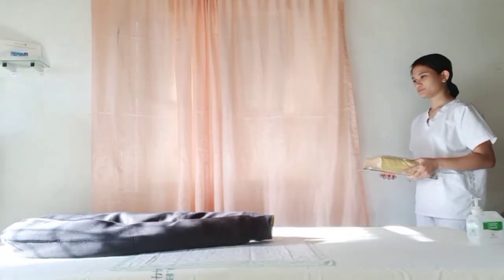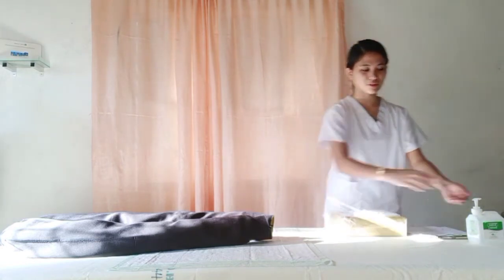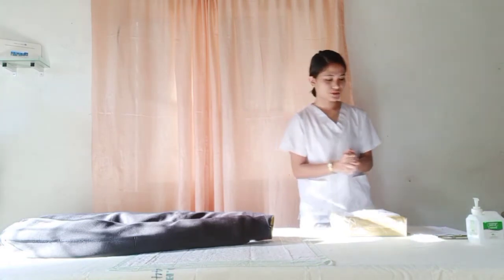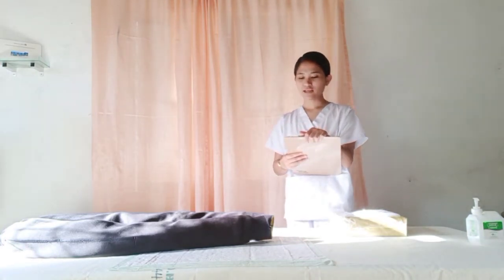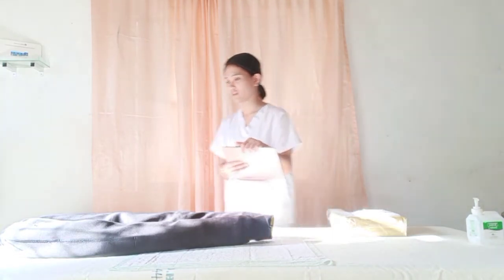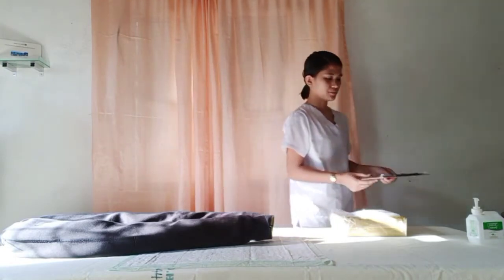Knock, knock, knock. Good morning, Mrs. Cruz. I'm Catherine, a student nurse who will be working with you today. How are you doing? Very good, perfect. Before anything else, Mrs. Cruz, I would like you to state your first name and your surname. How about your birthday? Perfect, thank you. Can I see your wrist just to check your name tag? Okay, thank you very much.